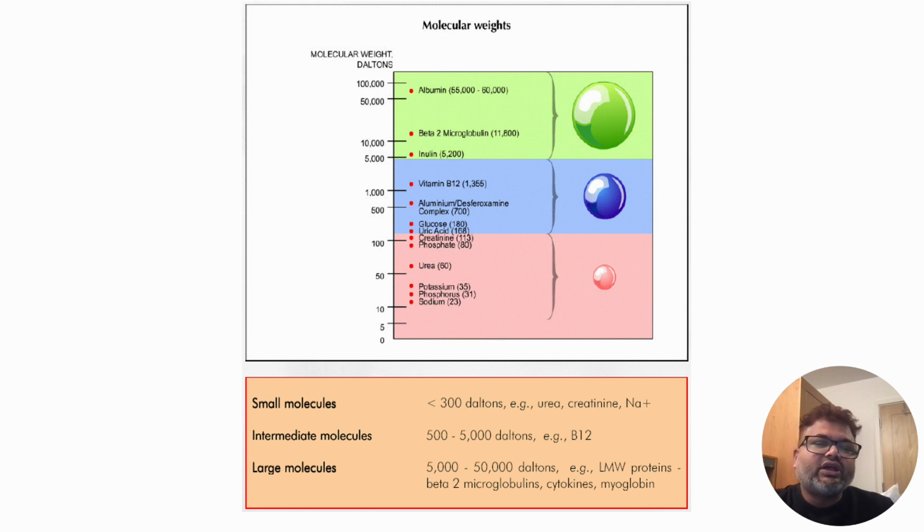Most of the time we need to remove low molecular weight metabolites like creatinine, urea, and potassium.